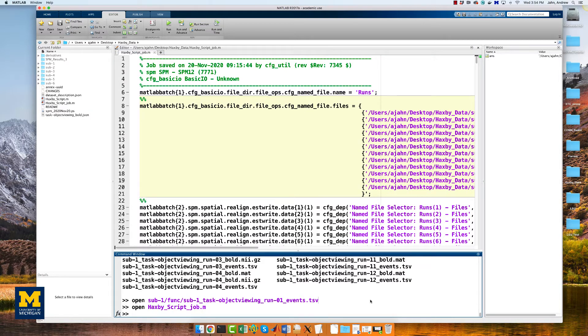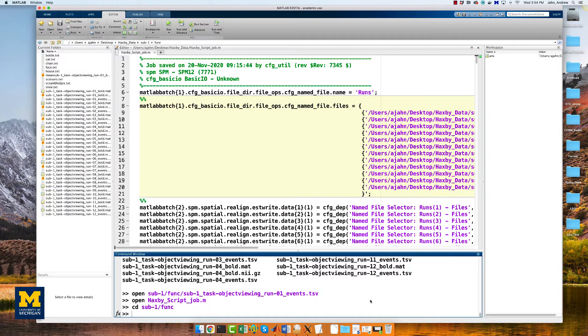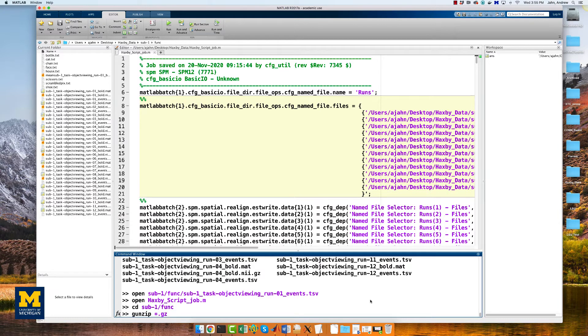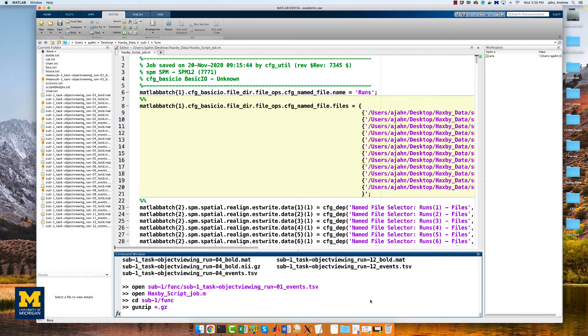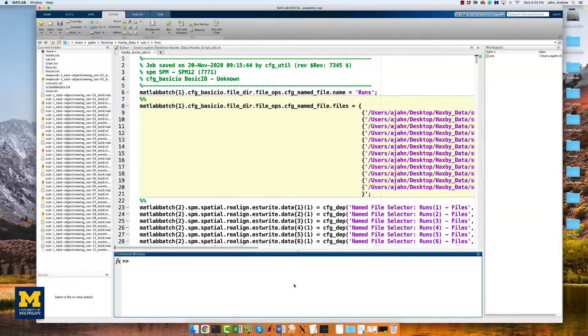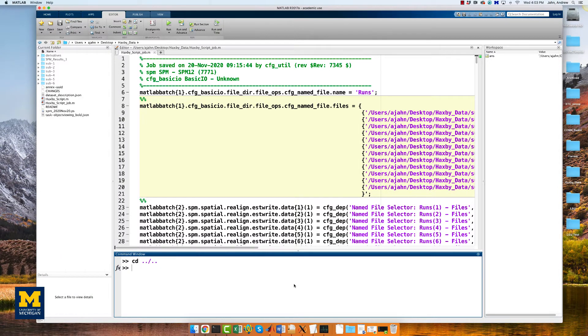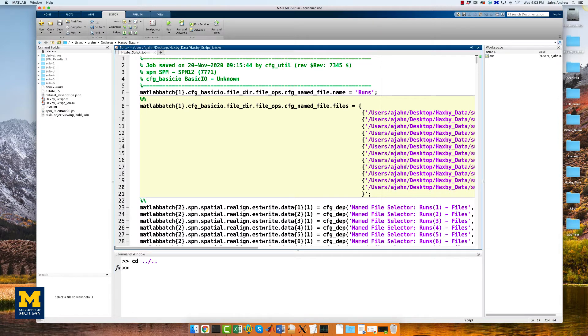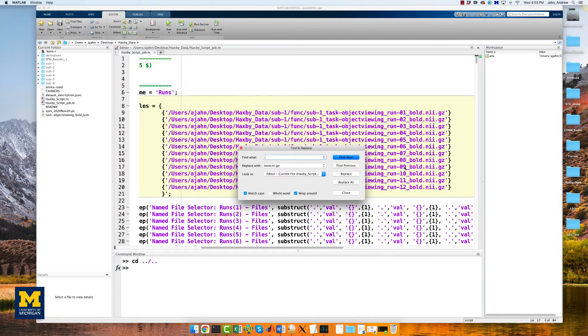We will first need to unzip the gzipped functional files so that they can be read by SPM. From the terminal, navigate to sub1 func and type gunzip *.gz. It's going to take a while to do this, so I'm going to fade out and come back when it's done. When it has finished unzipping the files, navigate back to the subject's directory, then go into the editing window, and replace .nii.gz with .nii.